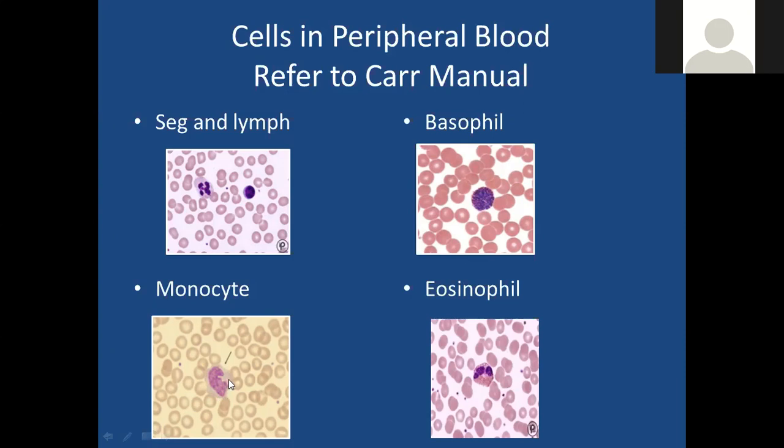Do any of you ever have problems differentiating colors? Okay, good. We pay a lot of attention to the way the cells take up the stain in hematology. So the monocyte cytoplasm coloration oftentimes is a distinguishing factor for the monocyte. It often has that gray cytoplasm.